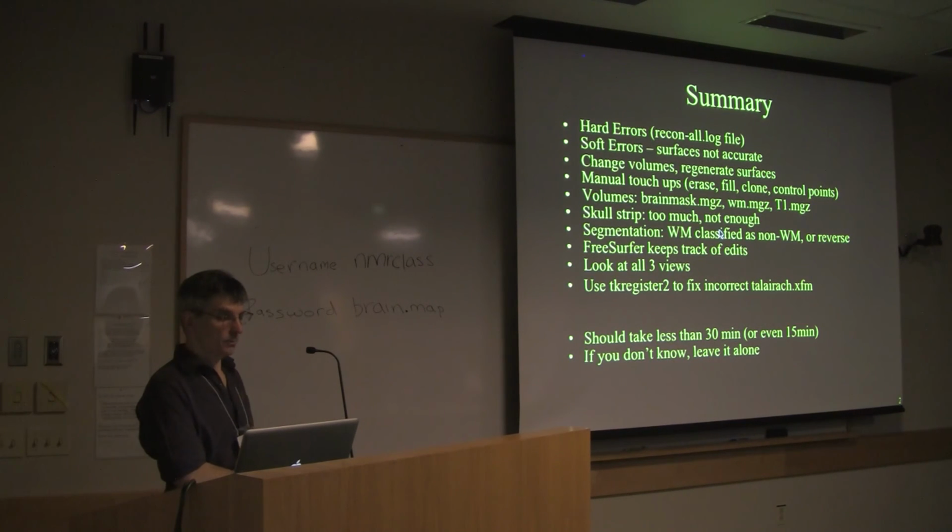So to summarize, you have hard failures where FreeSurfer itself does not run all the way through, so recon-all does not run all the way through. It crashes for reasons of disk space or permissions or something else that went wrong. More likely, what you'll have are soft errors. So hard errors are very, very, very infrequent, less than 1%, I would say.